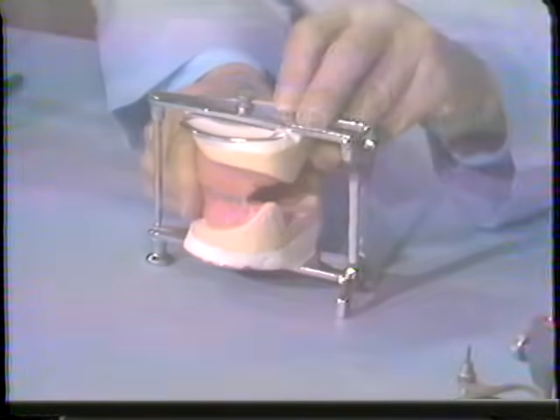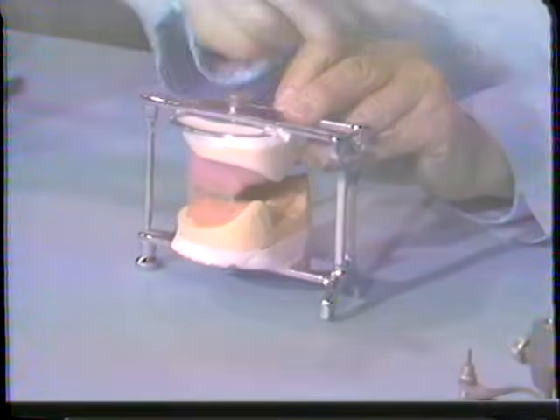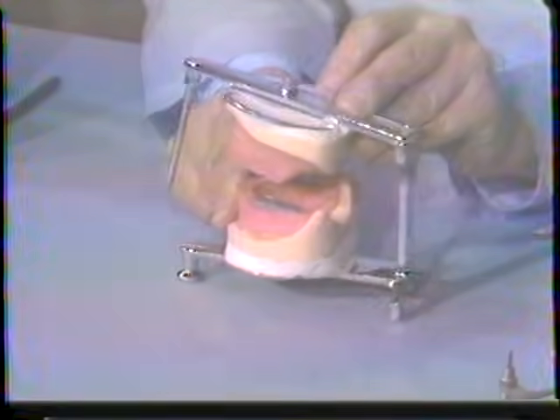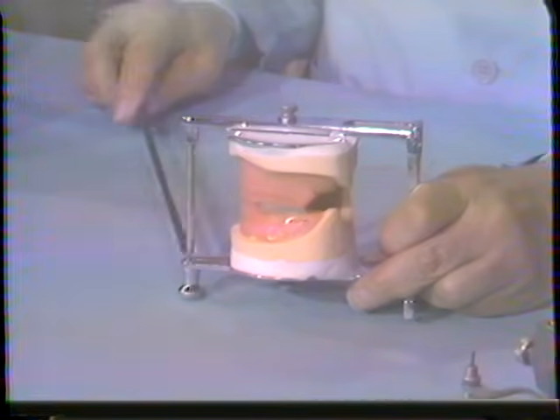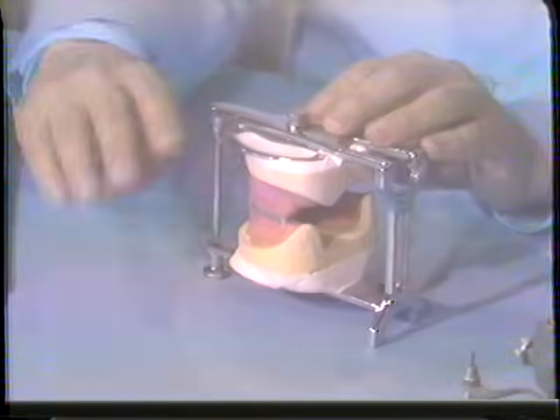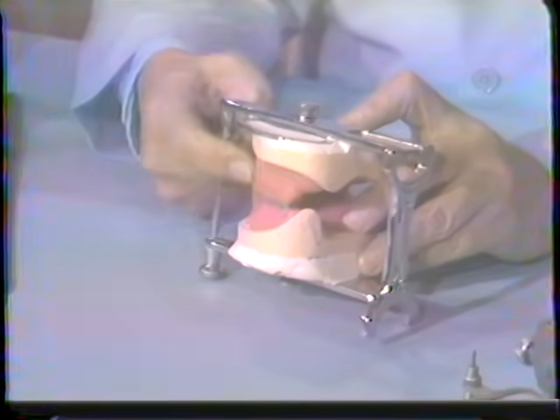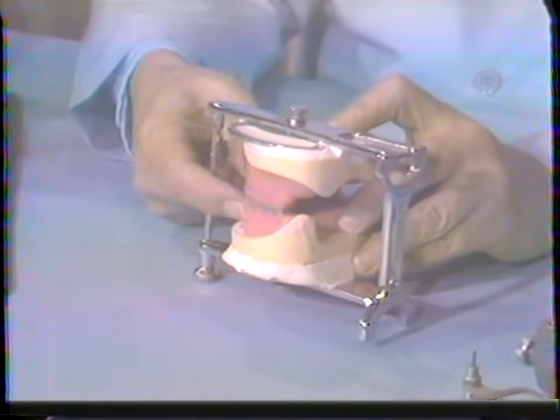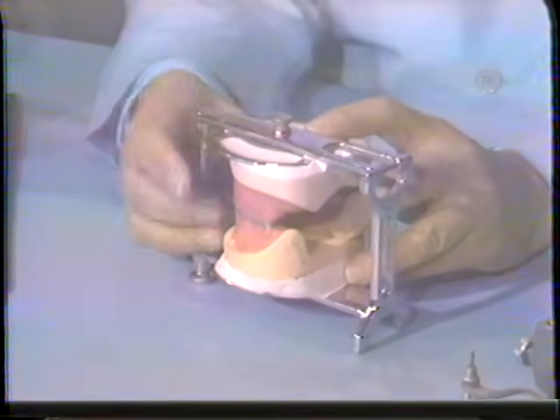Now the next would be a simple holding instrument again, utilizing only the centric relation record, also just on a hinge, but you see here incorporated an incisal pin. This now becomes an improvement in terms of holding this position. In other words, we don't have any bending of this instrument anyway. We can't go astray as far as the recorded vertical dimension between the jaws. So this anterior pin now holds this position more accurately. Still not able to make a facebow transfer.